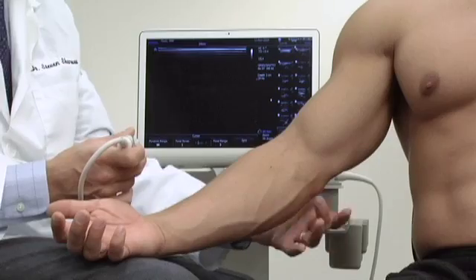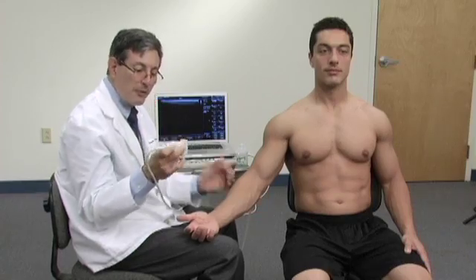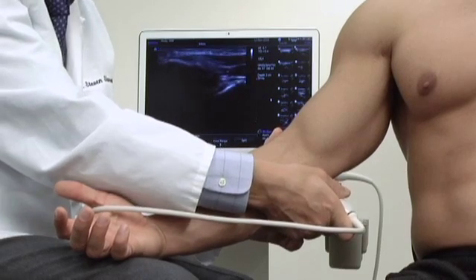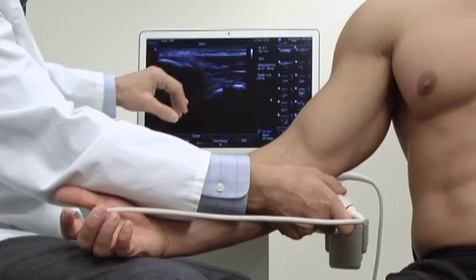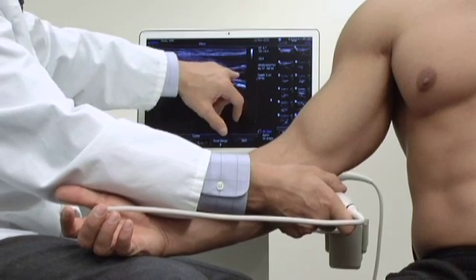Next we're going to evaluate the medial side of the elbow at the area of the common flexor tendon, where we commonly will see golfer's elbow. I'm going to place the probe so that the proximal end, the notch side on the left, is over the medial epicondyle. I'm going to align that with the flexor tendon right here. The flexor tendon of the elbow is very short, so we'll see that this is tendinous here and then the flexor muscles of the forearm are here.